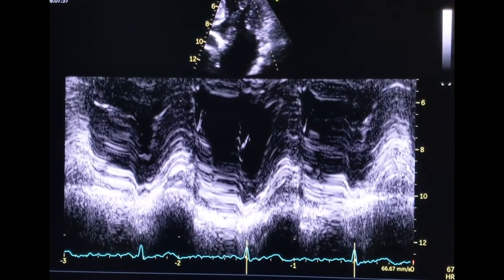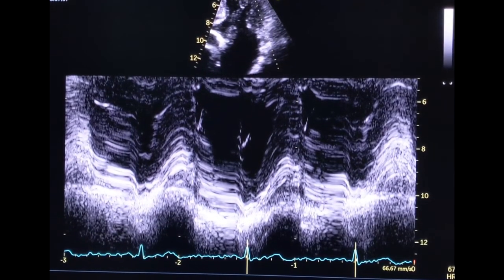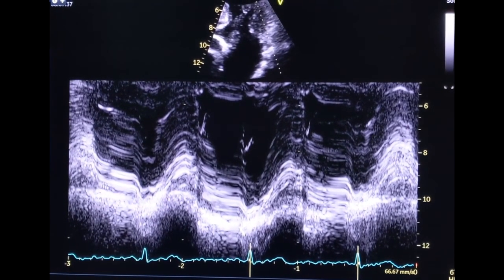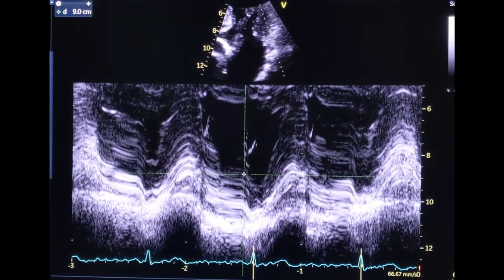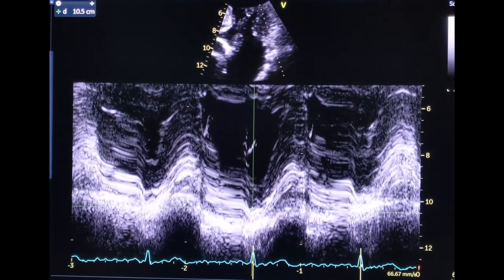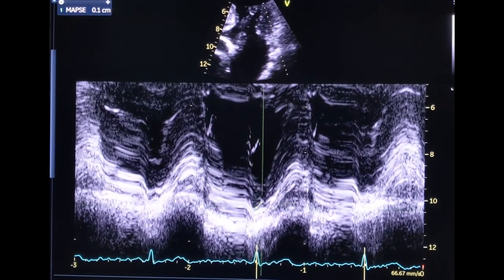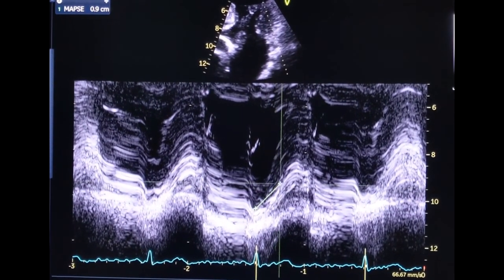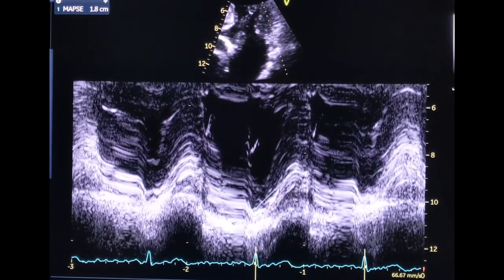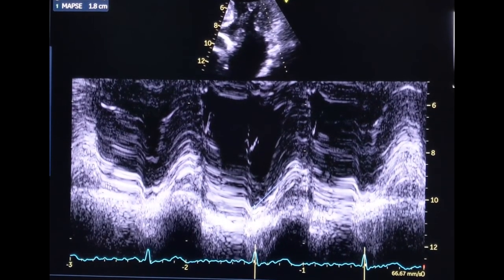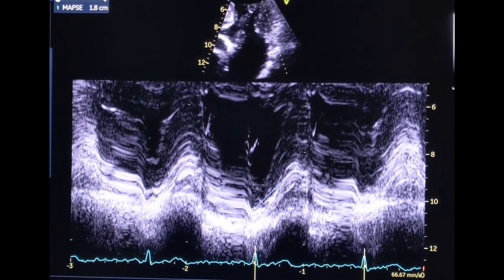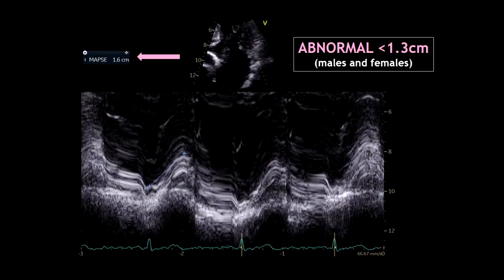Once you press the M-mode button, you should get something like this. And now we are ready to measure the excursion, which is the distance from the lowest point to the highest point. And that's it — this is how to obtain MAPSE. In this case, we have a MAPSE of 1.6 cm, which is normal.